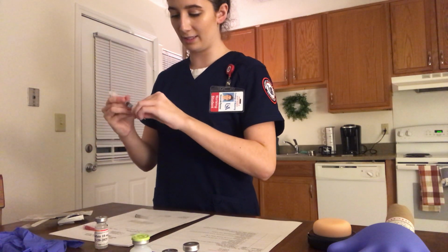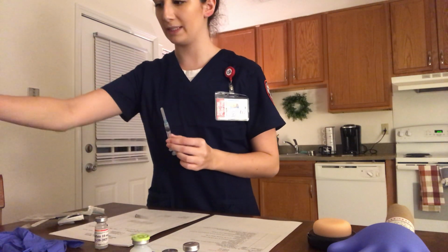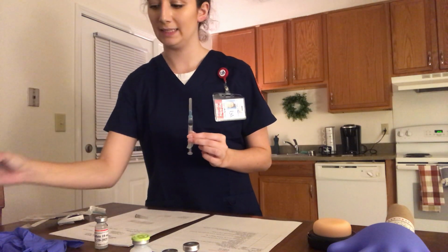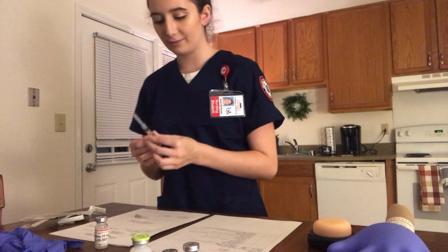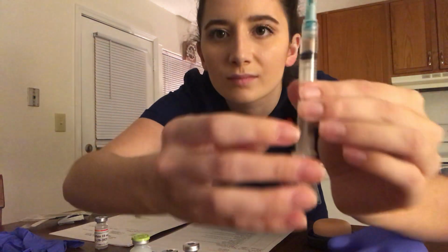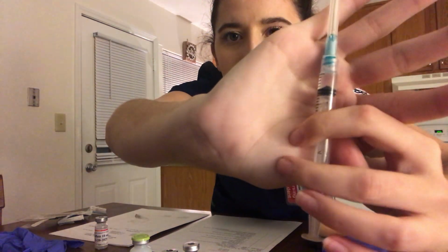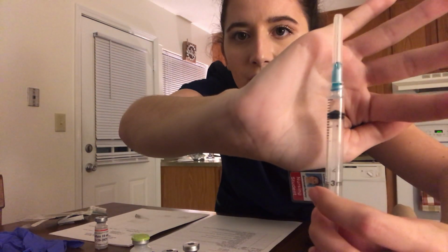Alright, and then I would attach the needle. And I would dispose of this in the sharps container, which I have right here. After that I will show you, it is at 1/2 milliliter. There are no bubbles.